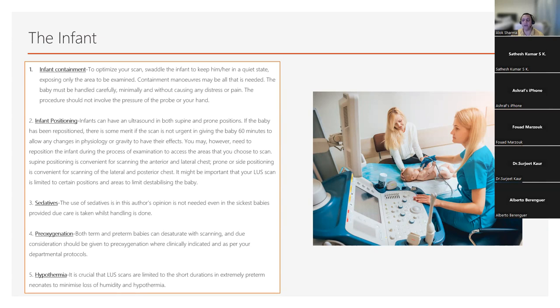And that's where I would say that when we implement lung ultrasound, we should do it as part of a standard guideline that takes into account the unit ethos with which we're using it. At the moment, where I work and where I've previously worked in Southampton, we use it adjunctively in addition to chest x-ray, as opposed to saying that we're not going to use chest x-rays at all. I will explain with each individual condition how that might be. But your guidelines should then have governance, which takes that into account.